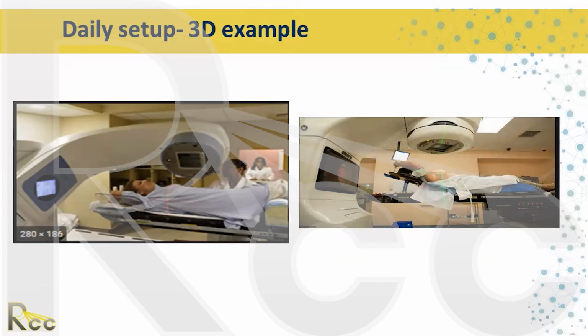And if it's mono ISO, then it's a little bit more automated. But if you're matching, you really want to go in the field and make sure that the edge of the light field matches the superior portion of your medial, matches your inferior portion of your superclav, so you don't get any kind of gaps or hot spots.